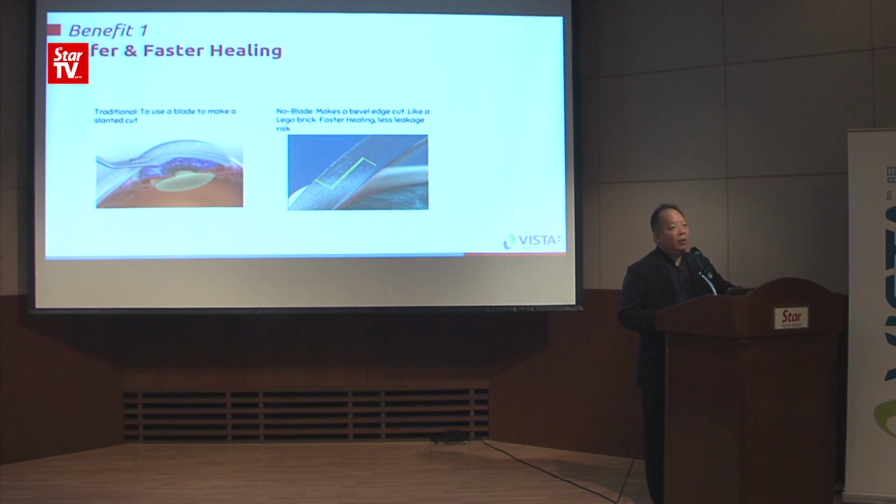Now, if we use the Femtosecond laser, because of the precision and accuracy involved in the wound, we expect, and we should expect, that it becomes a safer surgery, and the wound heals faster, and you don't really need stitches.